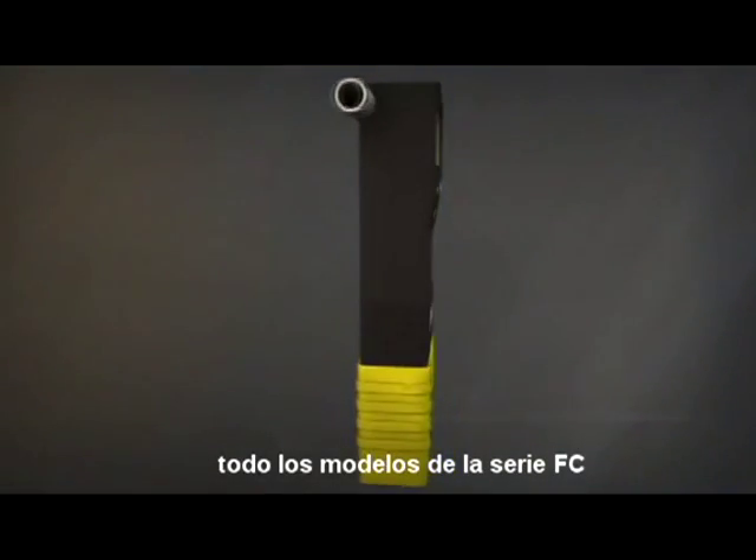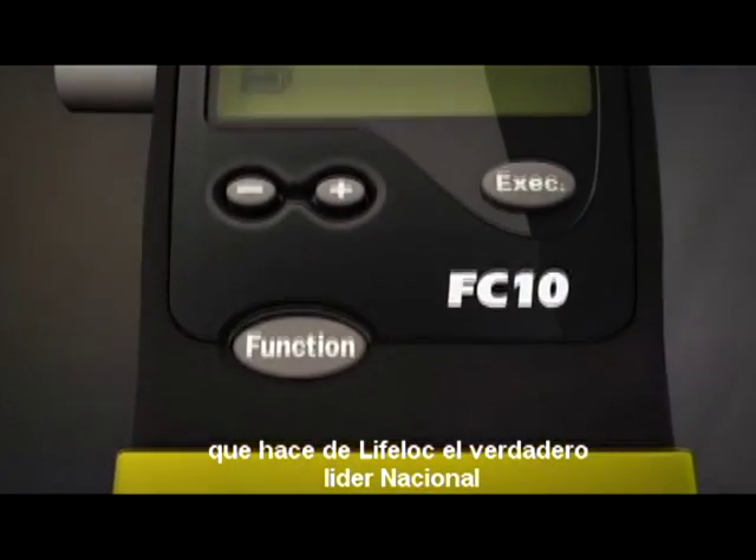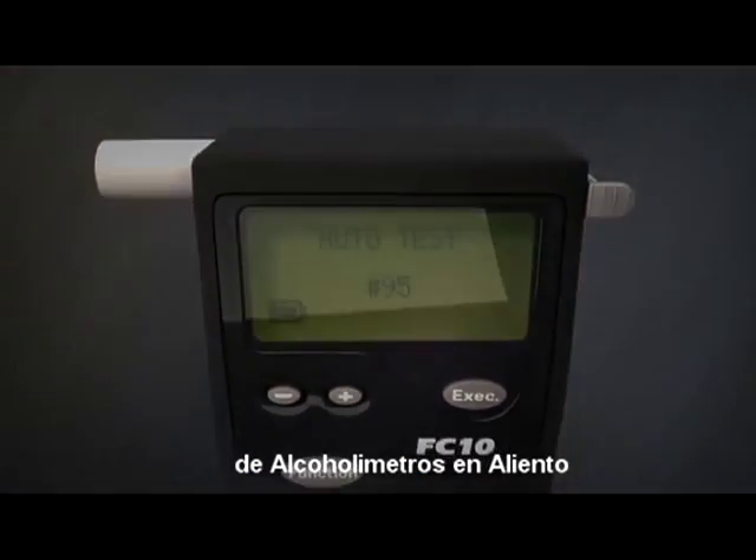Every model of the FC Series comes with a list of impressive features that have made LifeLock a trusted leader in international breath alcohol testing.